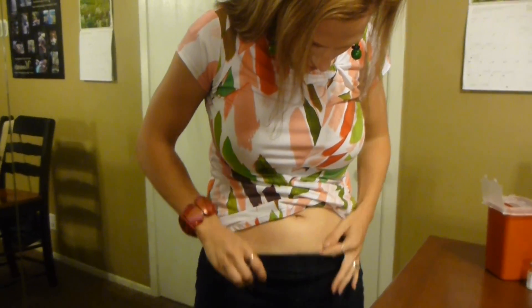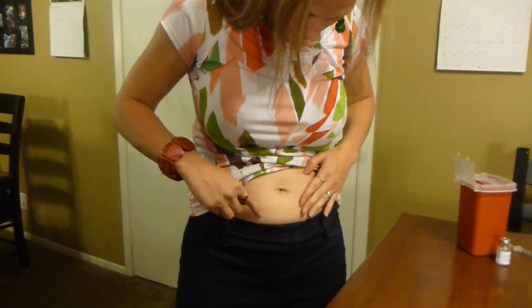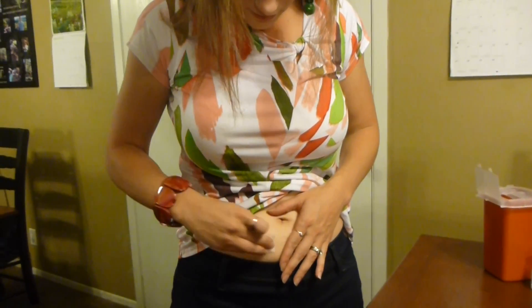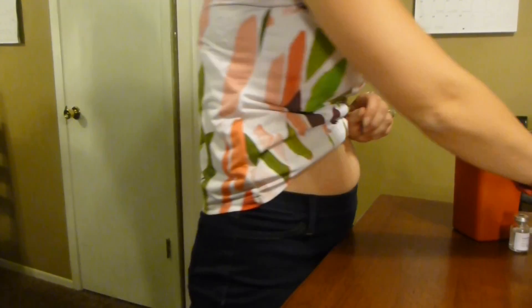Now is the time to definitely turn it off if you are not okay with shots, because I'm going to show you how it works. This doesn't hurt, so don't worry about it. What we're going to be doing is I'm going to be putting it in my belly region — I'm supposed to put it in kind of this area here. You can see that's where I got the tiny little bumps from the bigger needle. I don't remember what side I was on — I think this side — so I'm just going to swab that.